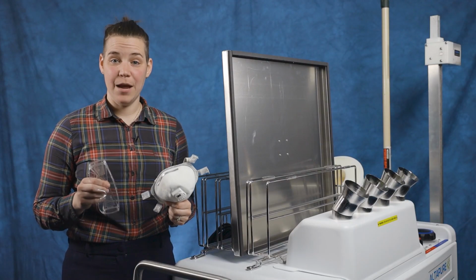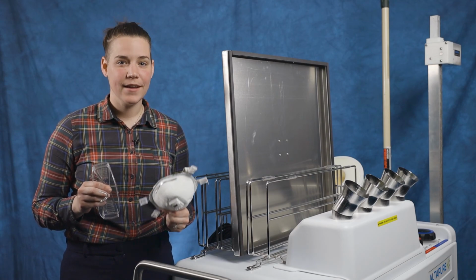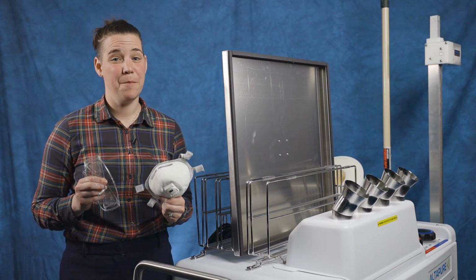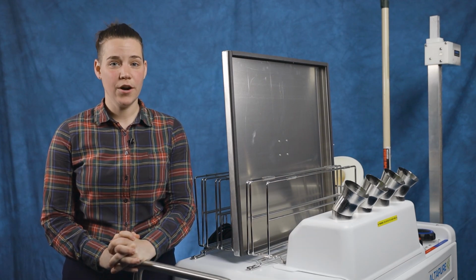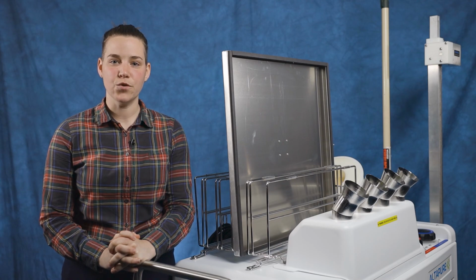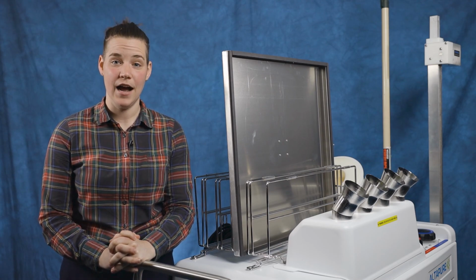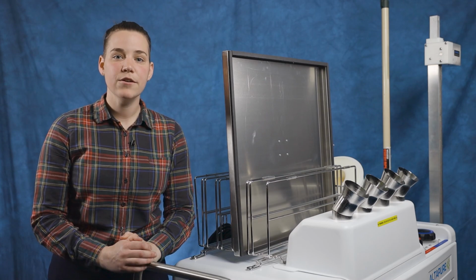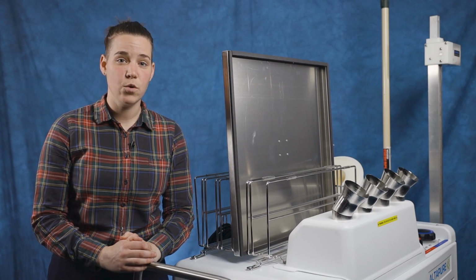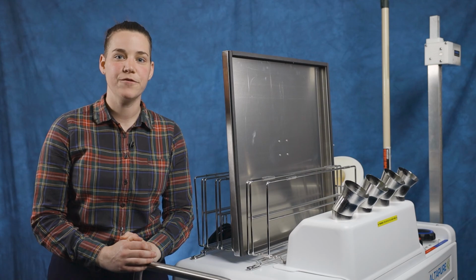Put on a mask and eye protection before entering the room. While the PAA is non-toxic, exposure to the submicron aerosol may be uncomfortable. If someone doesn't see the sign or disregards it and still manages to get into the room through the taped door, he or she may start to experience some coughing and eye irritation. They should leave and reseal the room immediately. The irritation to the eyes and lungs should dissipate quickly, but to speed up the process, they can wash out their eyes and go to a room with fresh air and breathe deeply.